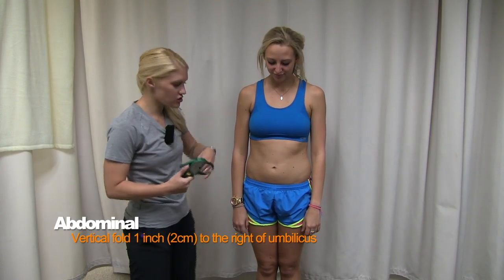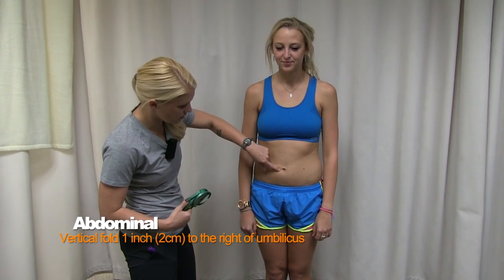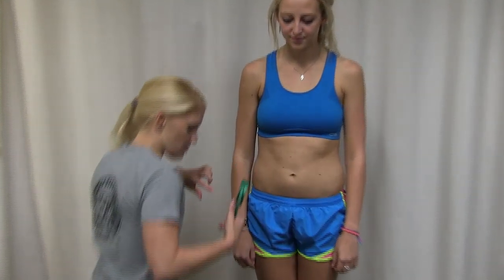Our next measurement is the abdomen. This one's straightforward — just one inch to the right of the subject's navel. Find the belly button and go one inch to the right.